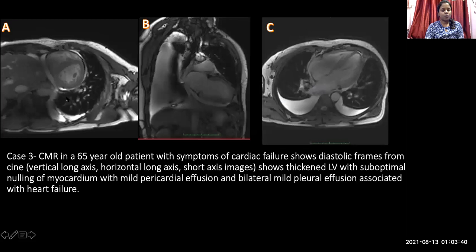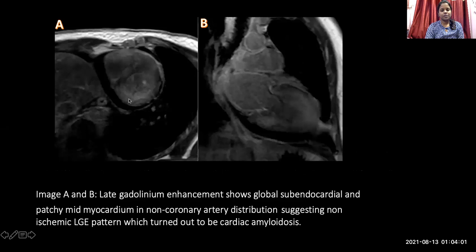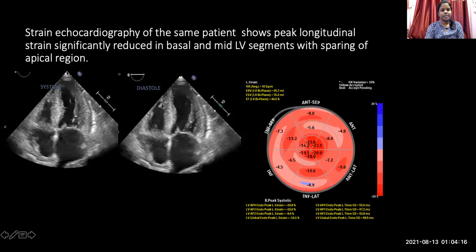The first case in the non-ischemic group is a 65-year-old male presenting with cardiac failure. Diastolic frames of cine images in the vertical long axis, horizontal long axis, and short axis show a thickened LV with sub-optimal nulling of the myocardium, mild pericardial effusion, and bilateral pleural effusion. The late gadolinium enhancement images show global sub-endocardial patchy mid-myocardial enhancement in a non-coronary artery distribution, suggesting non-ischemic LGE. This was confirmed as cardiac amyloidosis on fat-pad biopsy. Strain echocardiography done after the MRI diagnosis showed sparing of the apex with involvement of the base, characteristic of amyloidosis.